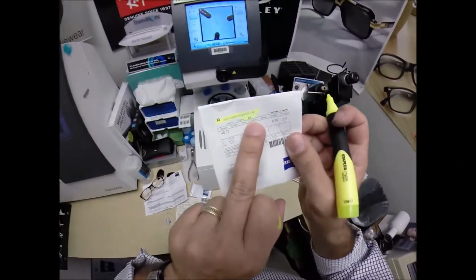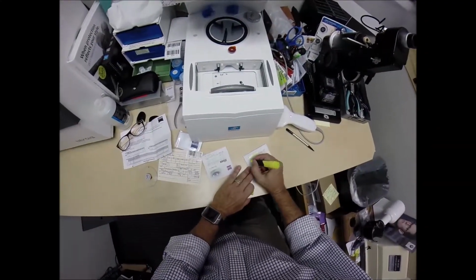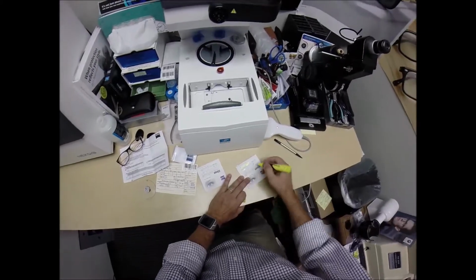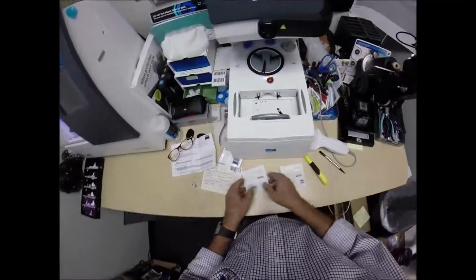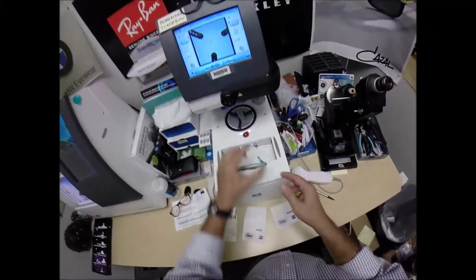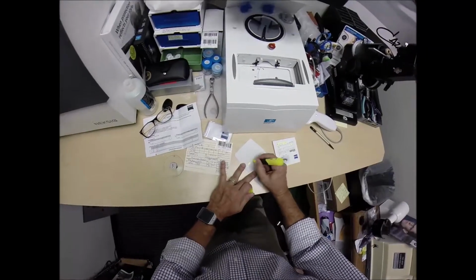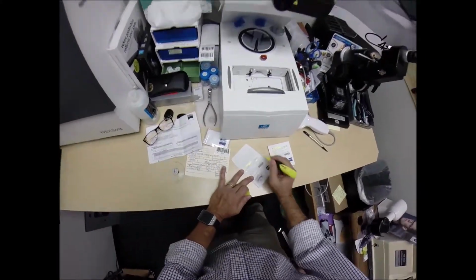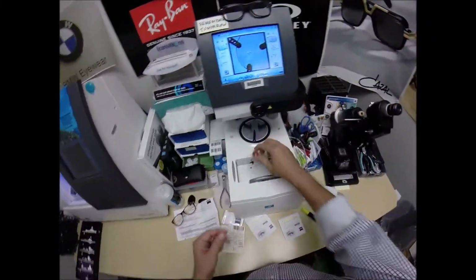I just highlighted the smaller line, the anti-glare coating, Duravision Chrome. The power for your right eye plus 75, your progressive strength 0.75. We're going to do the same thing for the left. Put that on the platform. Let's go ahead and highlight that. Same thing. The progressive, the powers, and I'll put that there. I'll need that a little bit later.